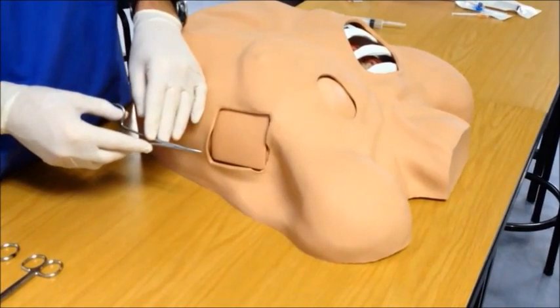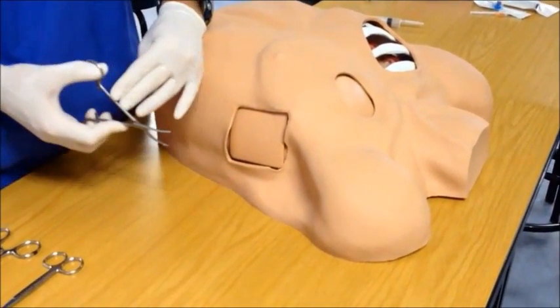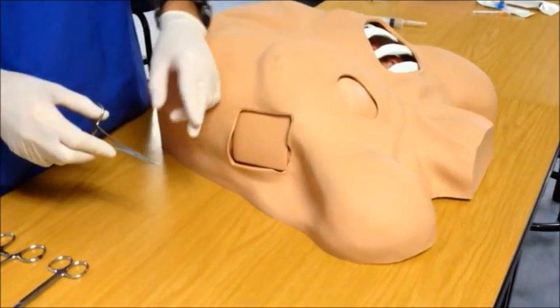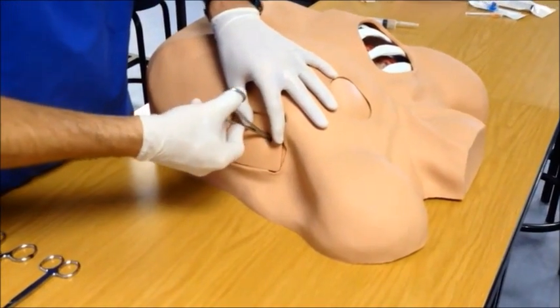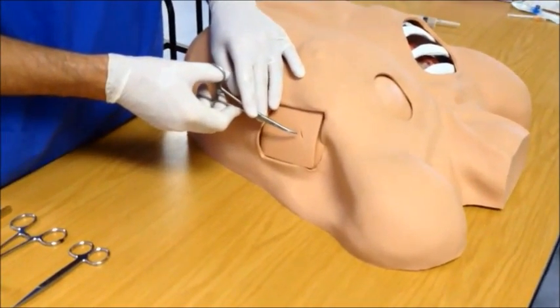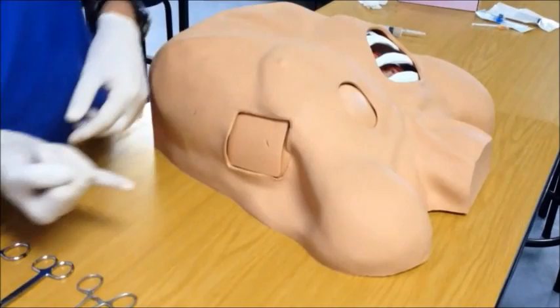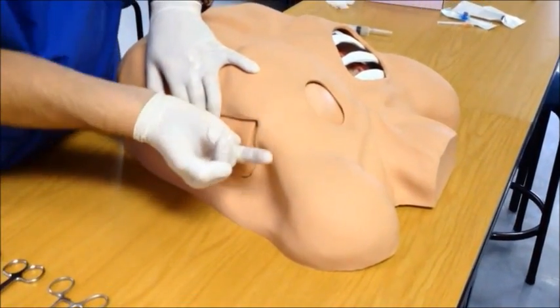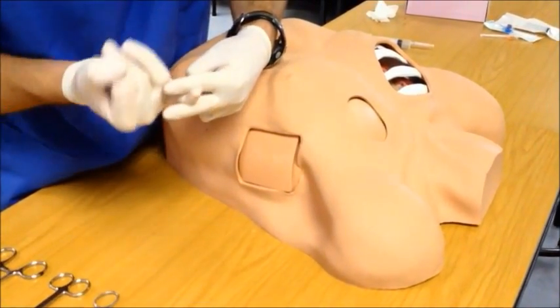Now use the curved artery forceps and a blunt dissection technique to enter the chest cavity. The principle is to insert, open and remove while open, then rotate through 90 degrees, insert, open and remove while open. This will tear and part the soft tissue until you can enter the chest cavity. Once you have entered the chest cavity, you often feel or hear a pop as you enter through the pleural space and you may get a resultant gush of air or blood. Use the smallest finger on your hand and insert it into the cavity, doing a finger sweep to feel for any adhesions, fractured pieces of bone, or other tissue.